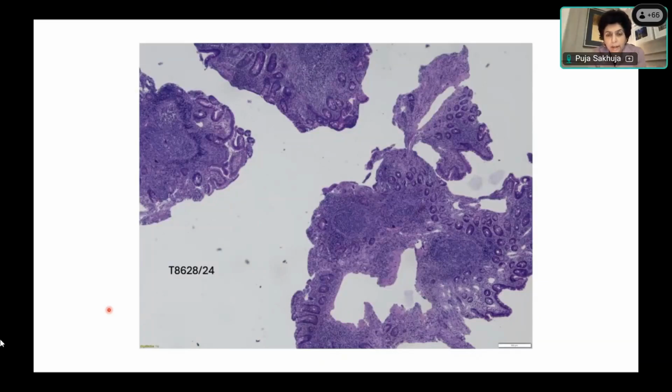So you said that there is normal villus pattern, right? Yes, ma'am. And you did say that it appears to be blunted in some areas, correct? Yes, ma'am. So now, tell me, Anusha, how should we comment on the villus pattern? When should we comment appropriately on the villus pattern in a duodenal biopsy? Ma'am, generally, in celiac disease and all, we'll see the villus atrophy.